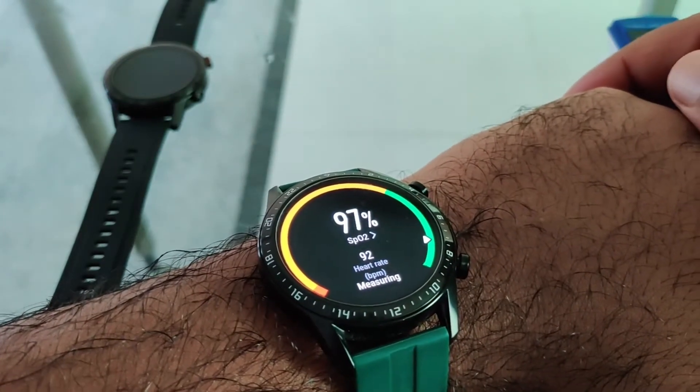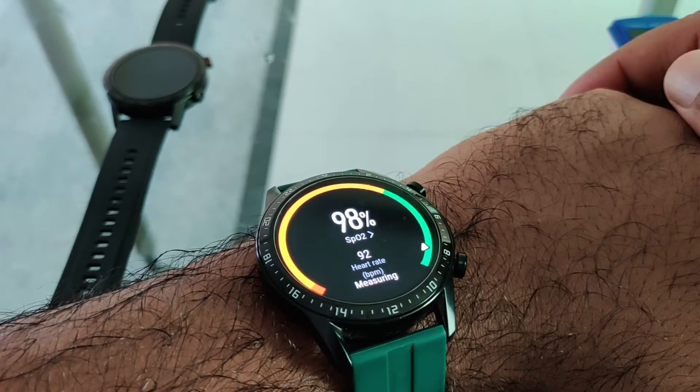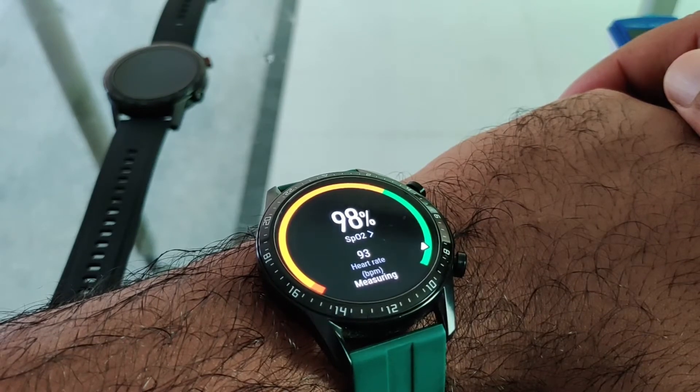The readings from the Huawei GT2 are very similar to the pulse oximeter. While measuring, you want to make sure that your hand is still and the watch is facing up.